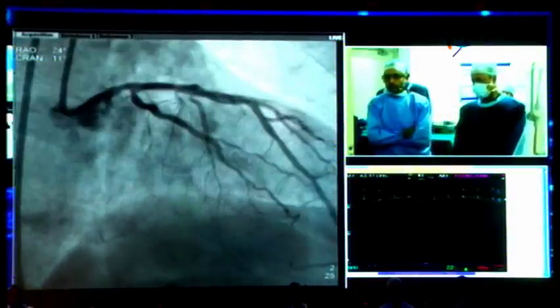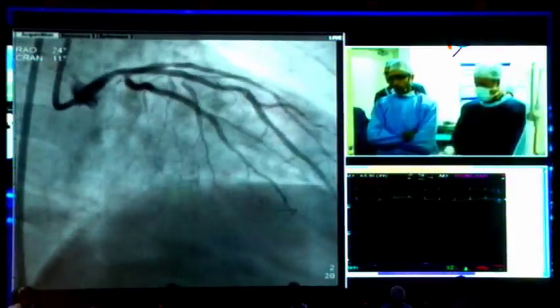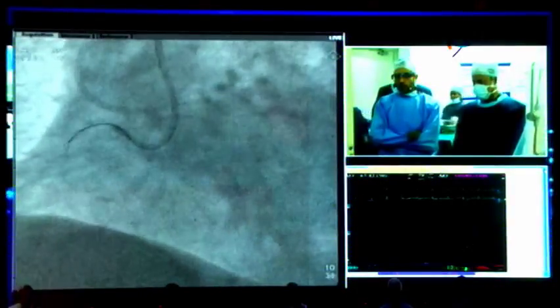So anyways, now, all right. So the right. What do we do now? Now your plan is actually antegrade now, right? Correct. Antegrade, and you're taking which wire, and what was the approach taken here?